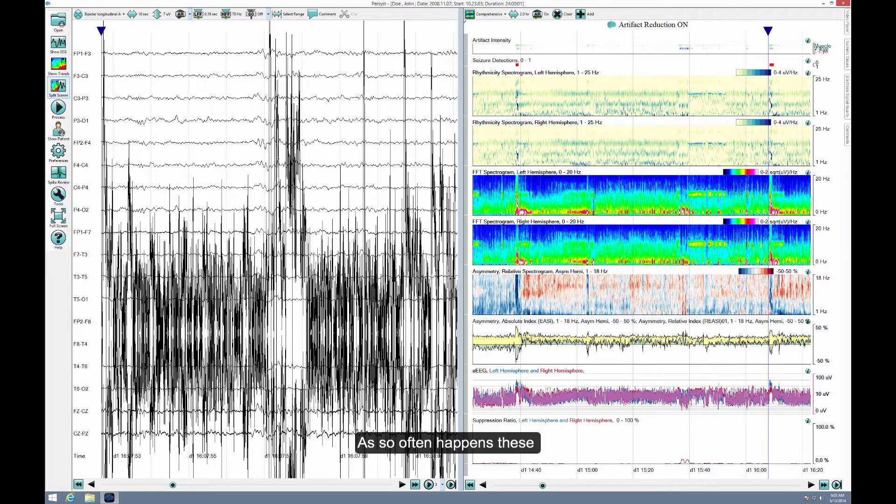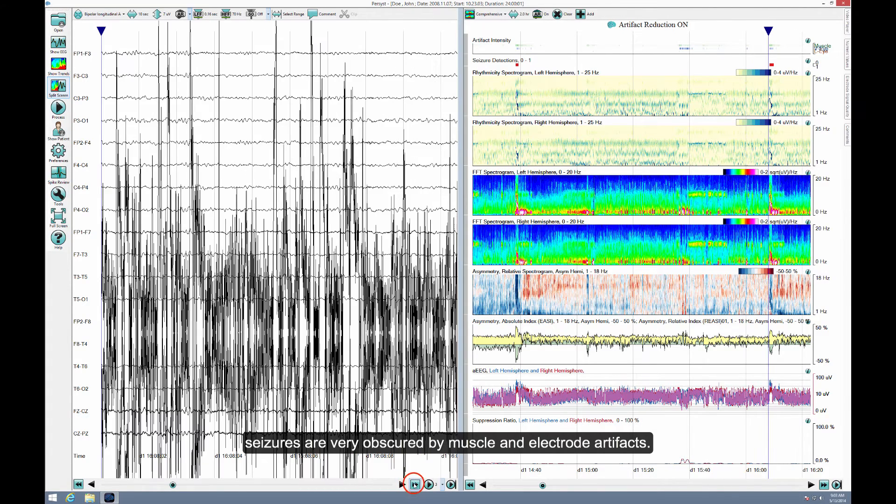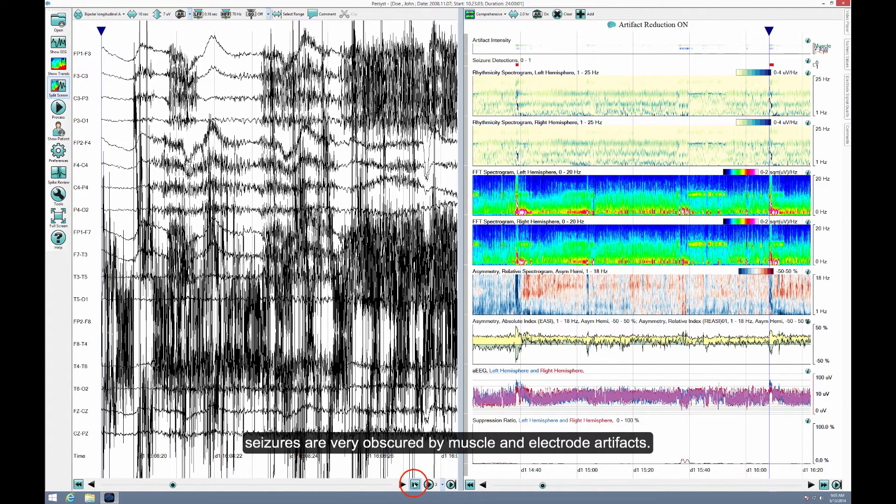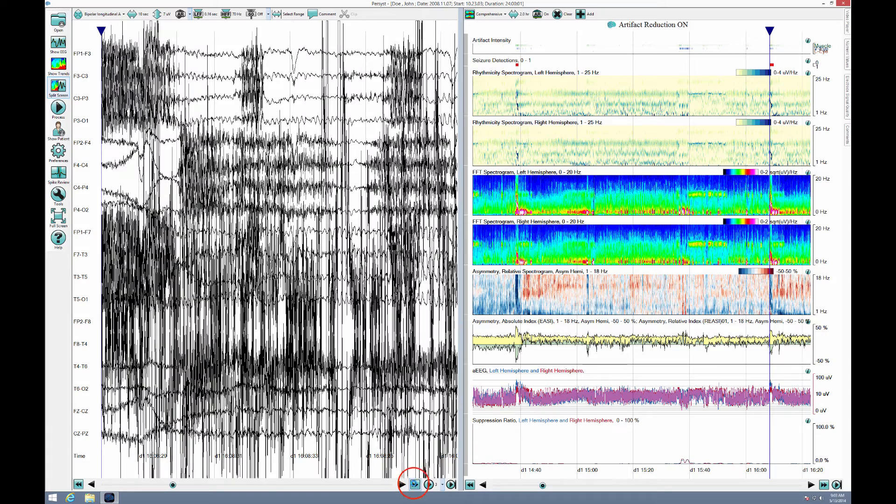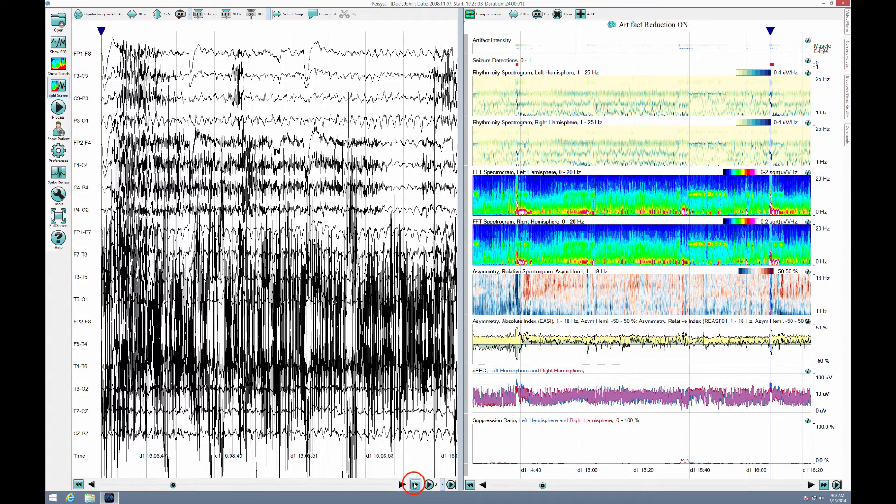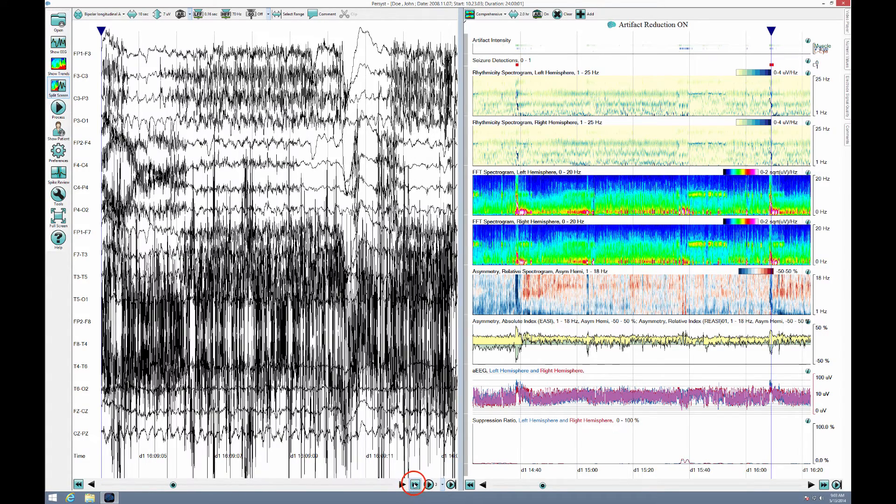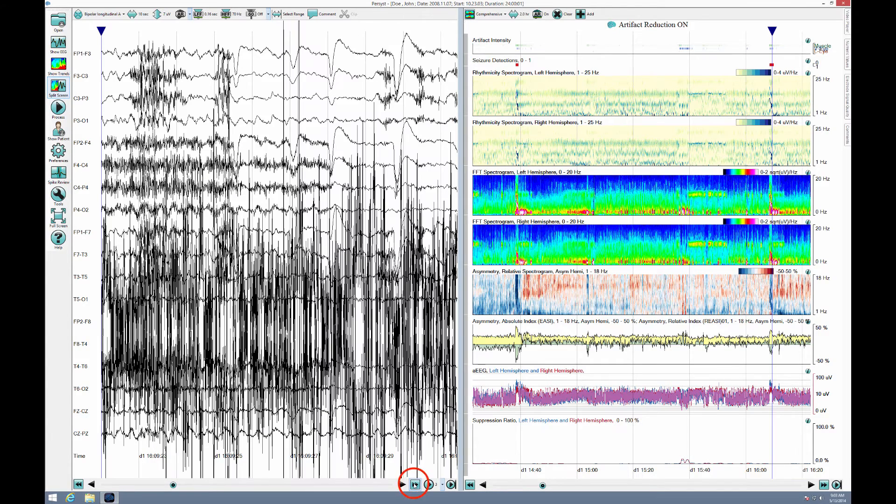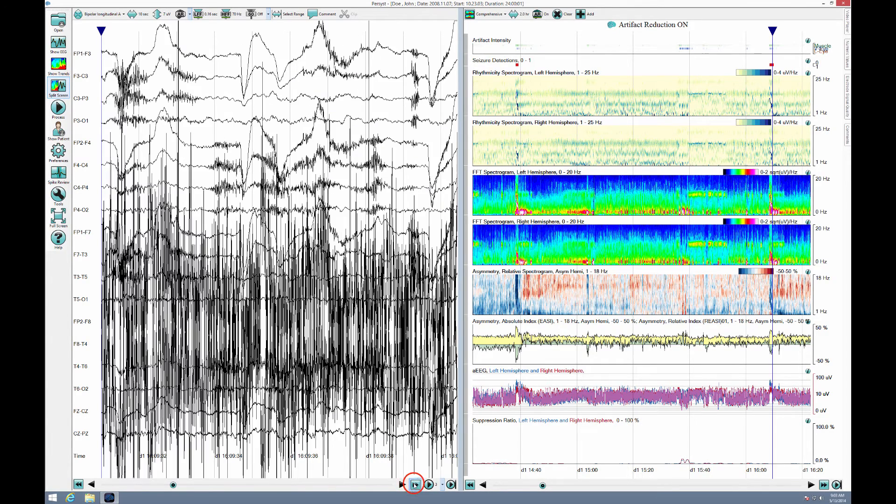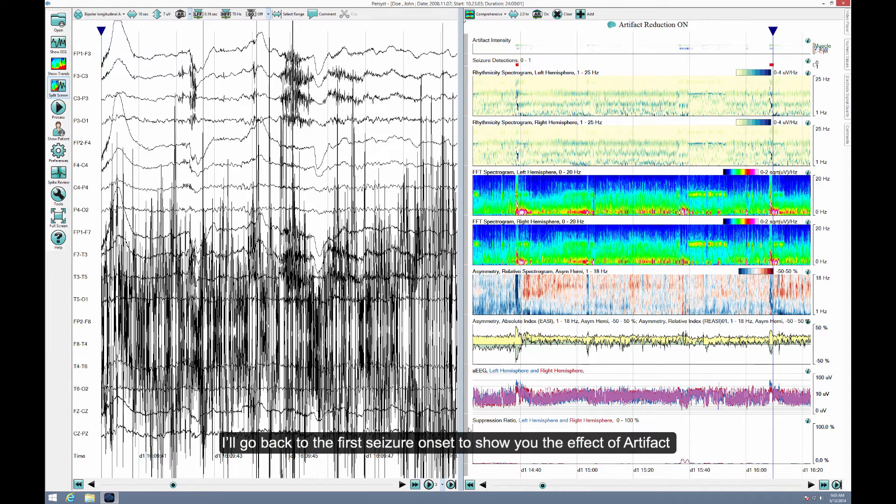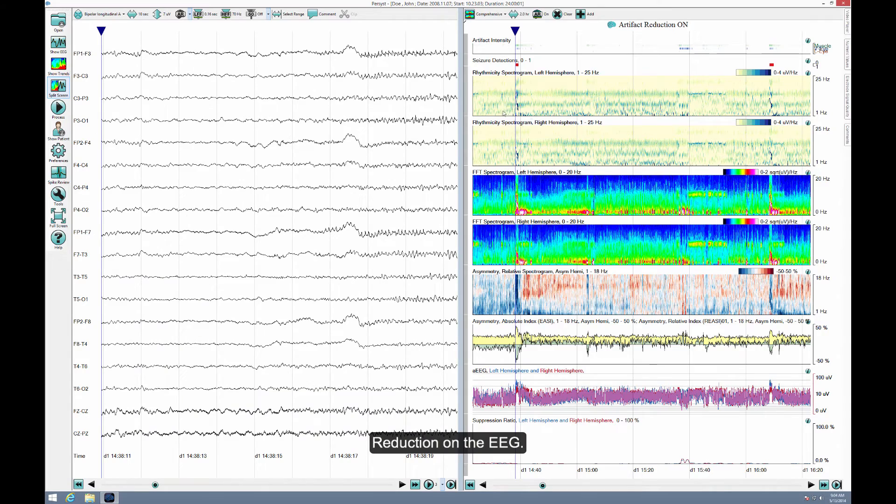As so often happens, these seizures are very obscured by muscle and electrode artifacts. I'll go back to the first seizure onset to show you the effect of artifact reduction on the EEG.